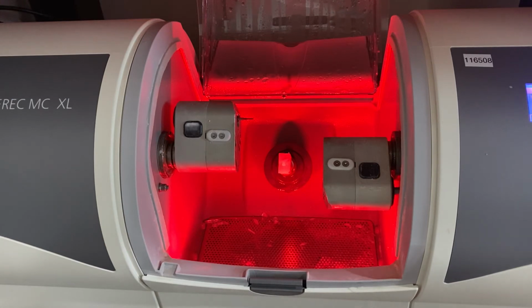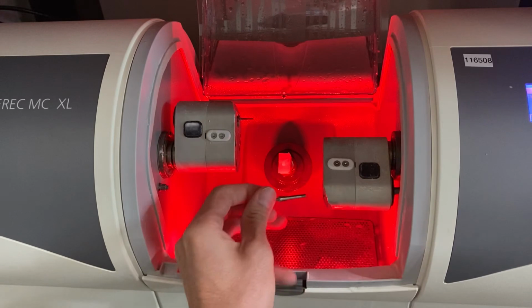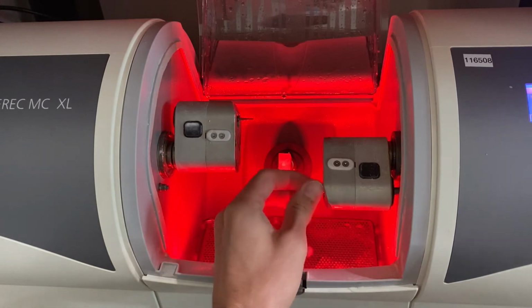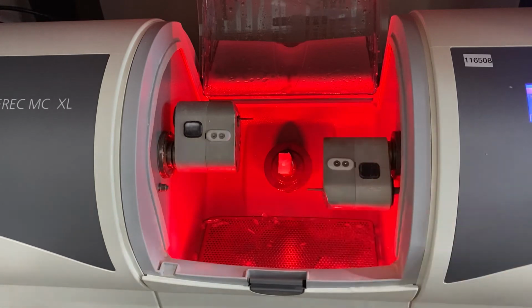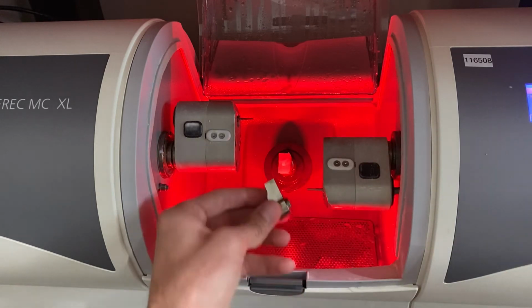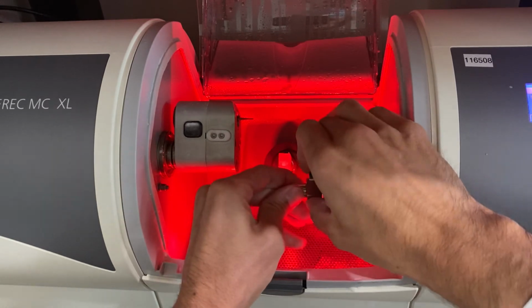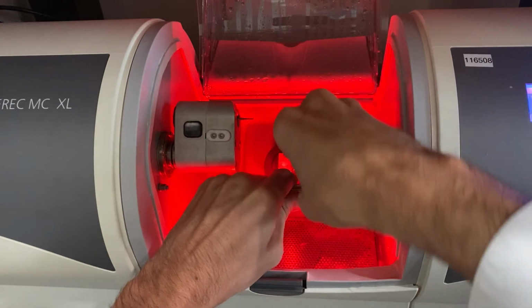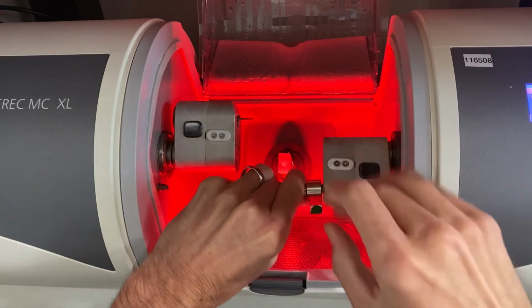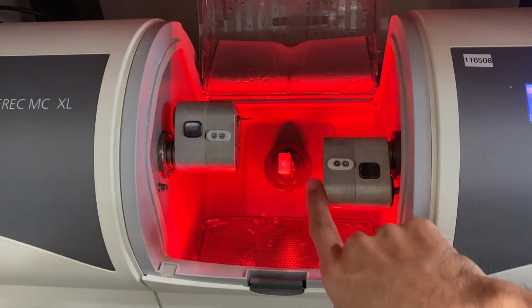Then you take your new one, then you slide it in, and you just turn it clockwise, and then slide your instrument tool back over it, hold it in, and turn it, and then you'll feel it kind of catch or kind of slip, and then you're finished.